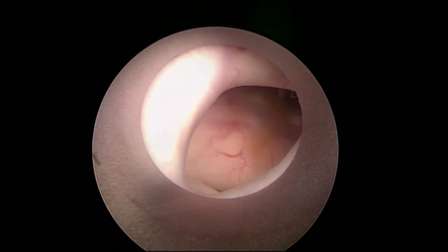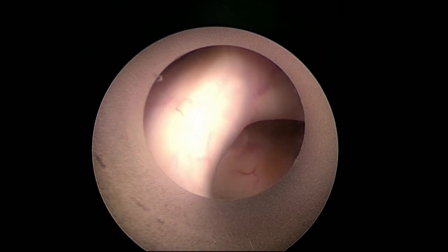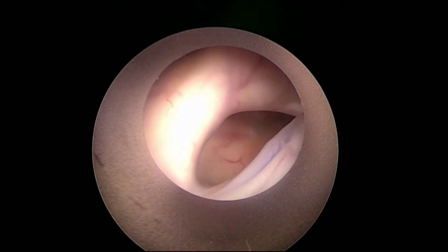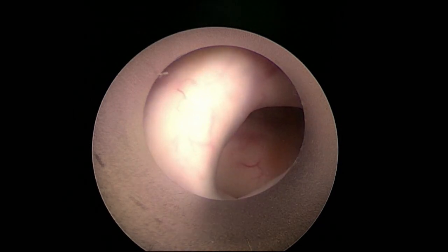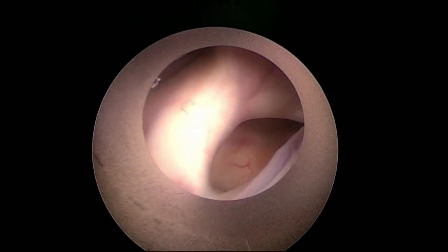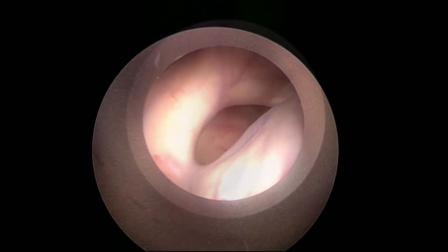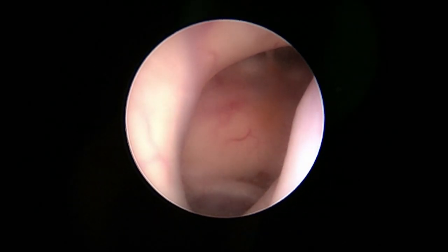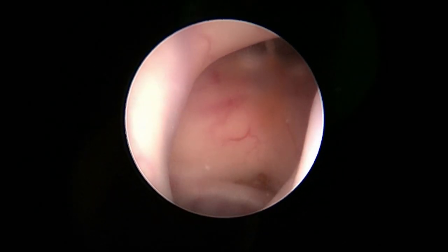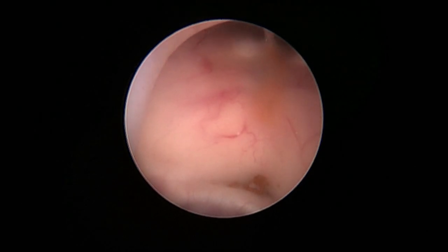Upon reaching the foramen of Munro, there is a clear discrepancy between the diameter of the endoscope sheath and the size of the foramen. In order to avoid injuries in the area of the foramen of Munro, the endoscope sheath is inserted using the optical obturator, which serves to dilate the foramen somewhat.